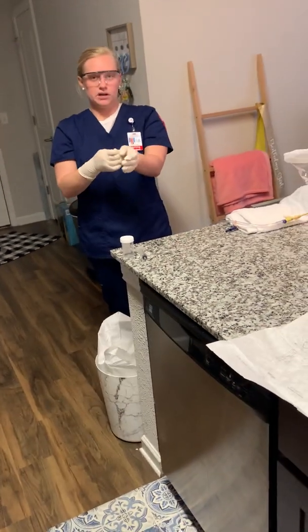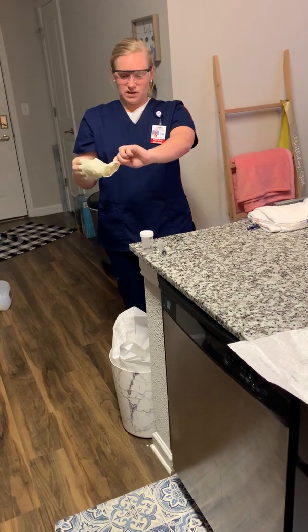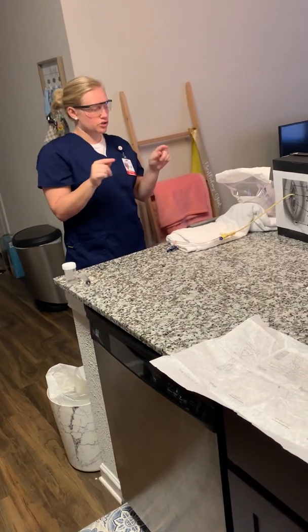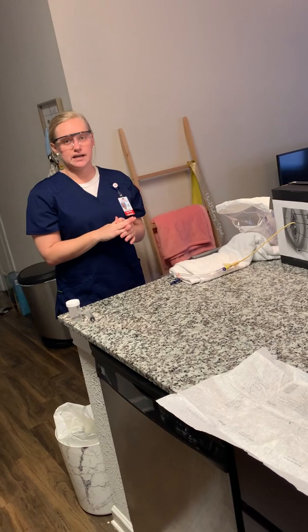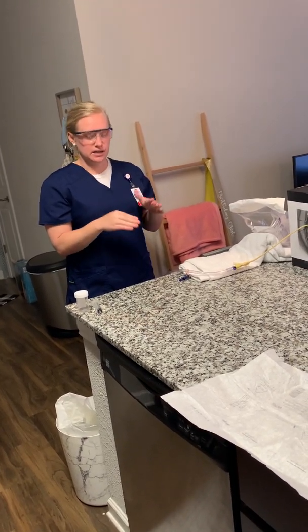I could remove my gloves and perform hand hygiene. I also want to put the side rail back up and the bed back to a low position and make sure the call light is in reach and that anything that the patient needs is in reach.